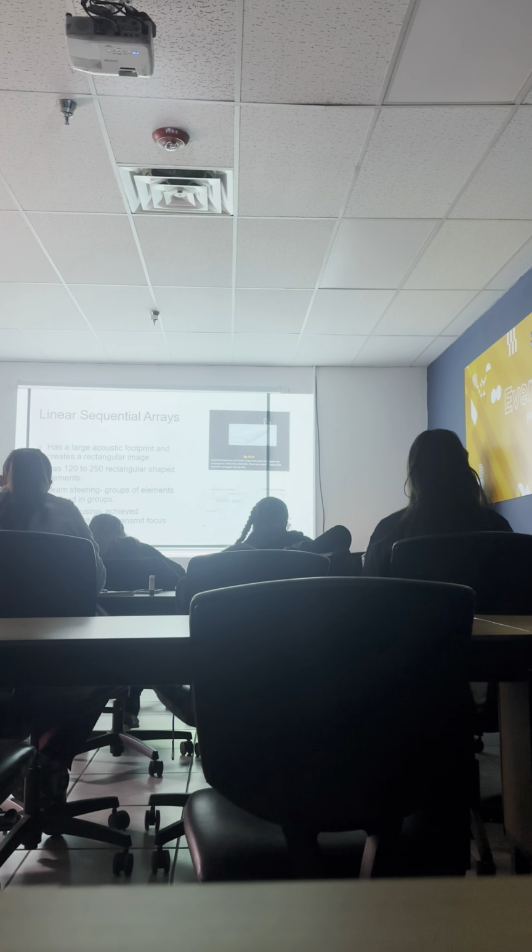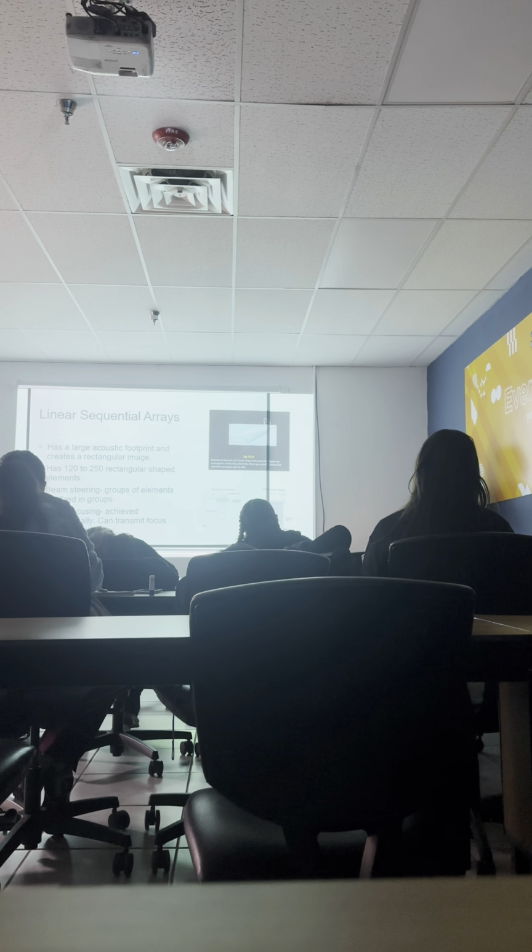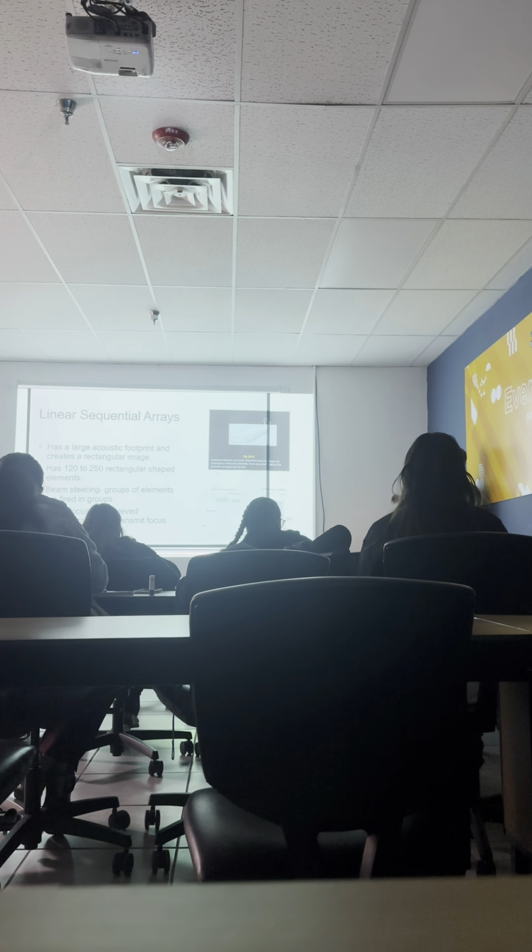So this does beam steering. Beam steering means that the elements are fired in groups. Phasing is the individual crystals being fired; beam steering uses groups of elements. So they could have like 10 elements firing at the same time. Beam focusing is achieved electronically.